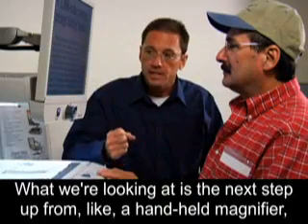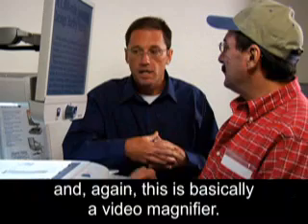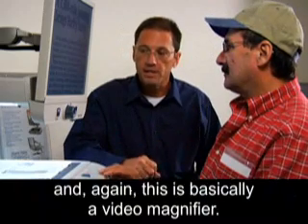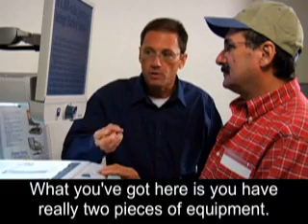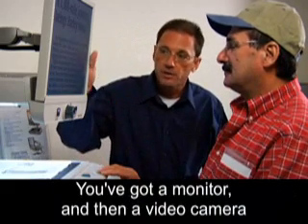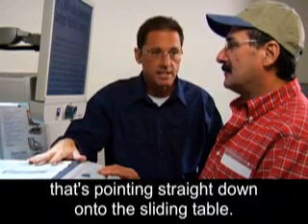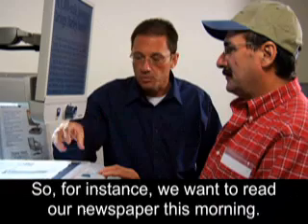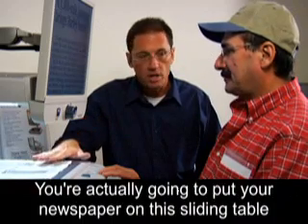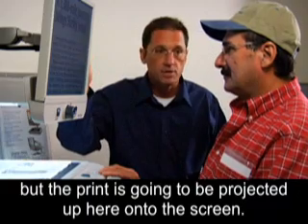This is a next step up from a handheld magnifier — basically a video magnifier. What you've got here is two pieces of equipment: a monitor and a video camera pointing straight down onto the sliding table. For instance, if we want to read our newspaper this morning, you put the newspaper on the sliding table and the print is projected up onto the screen.